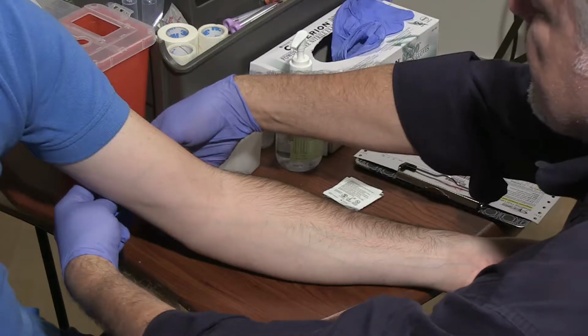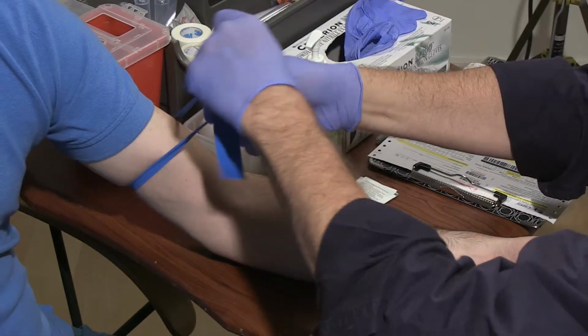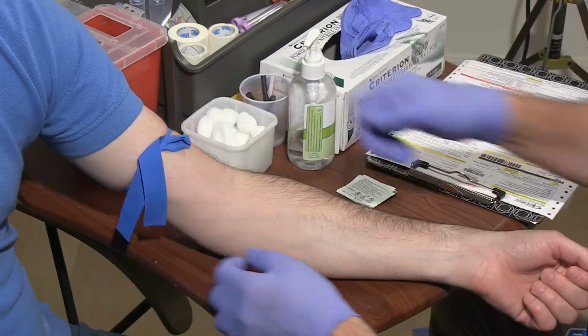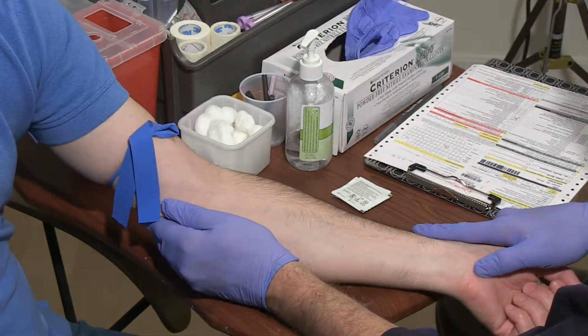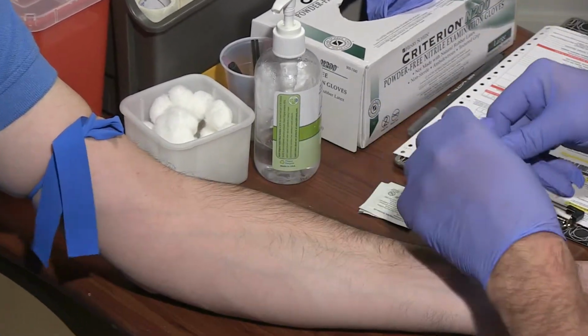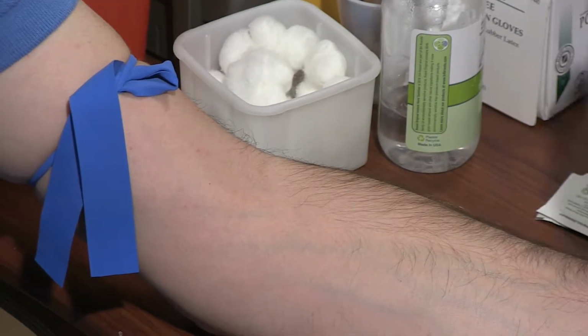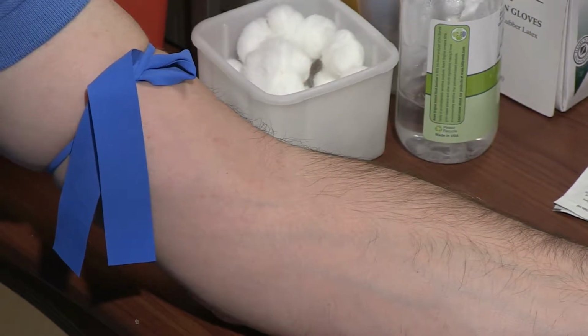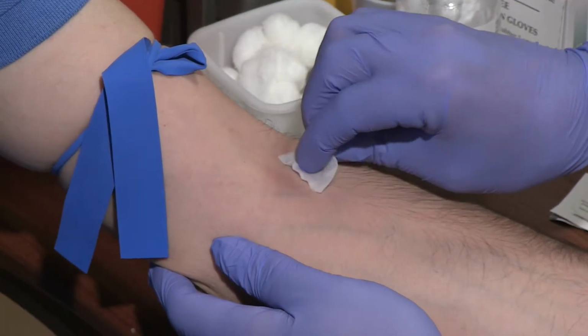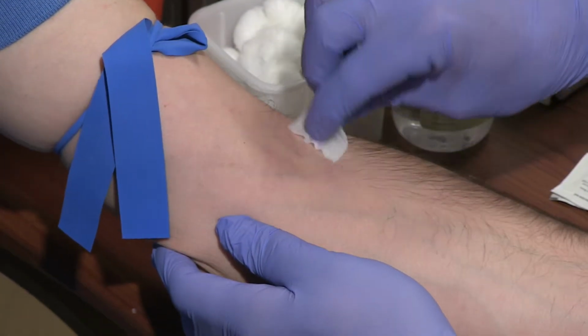After placing the patient in the correct position and collecting all the required supplies, the medical assistant applies a tourniquet to the upper arm. The tourniquet should be tight enough to obstruct venous return, but not so tight as to obstruct arterial blood from flowing into the limb and distending the veins. Next, the medical assistant identifies a vein for puncture in the antecubital space.